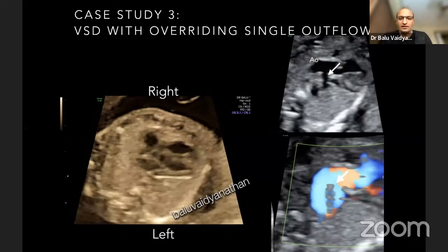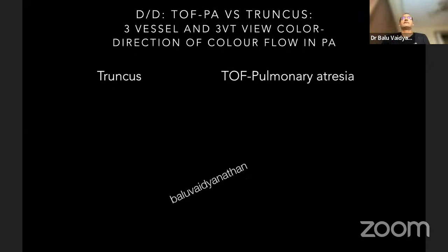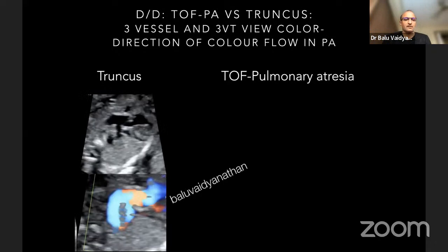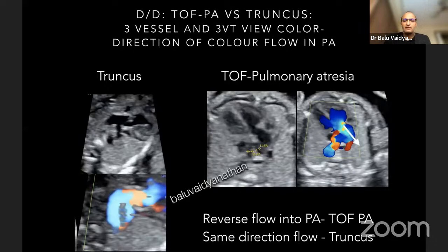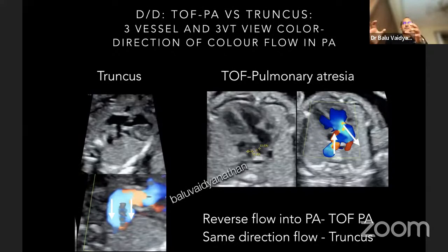There are two lesions where you have a VSD with an overriding vessel and a single outflow: one is a common arterial trunk and the second is TOF with pulmonary atresia. These two lesions need to be separated. You need to look at the color flow and see how the flow into the pulmonary artery is. In TOF with pulmonary atresia, there will be forward flow into the aorta but retrograde flow into the pulmonary artery, because the pulmonary artery is fed through the ductus arteriosus. However, in the common arterial trunk, there will be forward flow into the aorta and also forward flow into the pulmonary artery, as both arise from the single trunk. In common arterial trunk, the direction of flow of PA and aorta are the same.